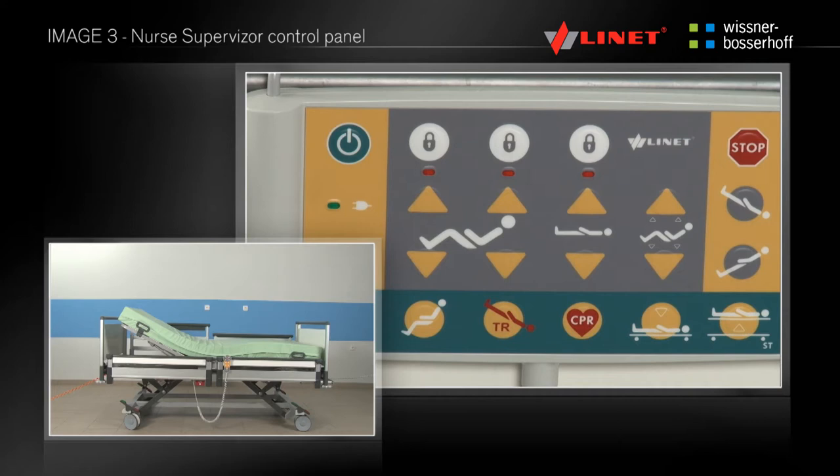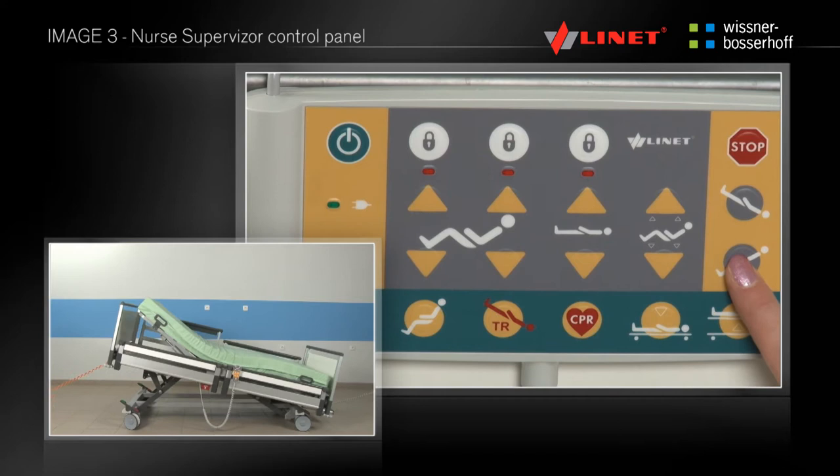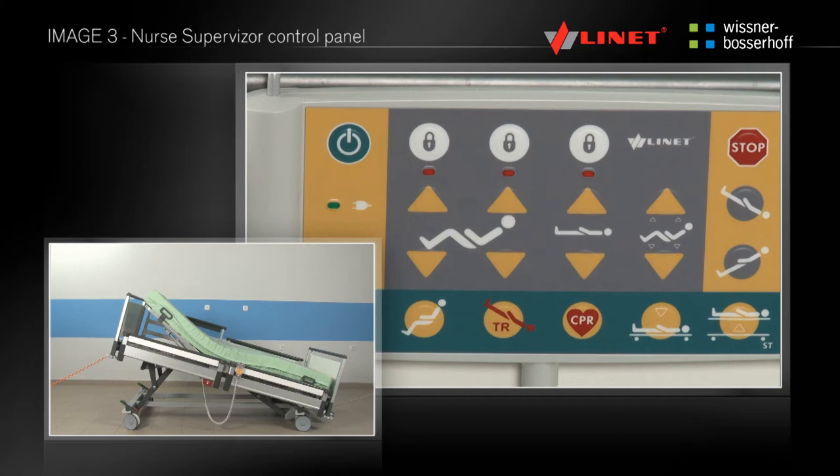In the yellow zone located on the right side of the driver, there are located the buttons for longitudinal tilt of the bed towards the head and the feet of the patient. These functions do not flatten the mattress platform, meaning the back or thigh rest remains in the same position.